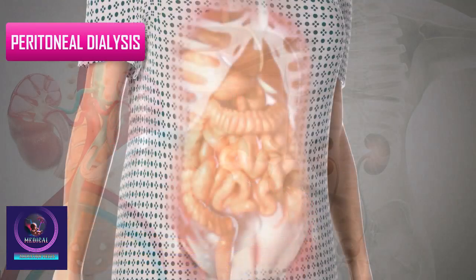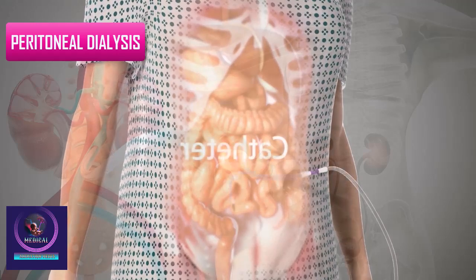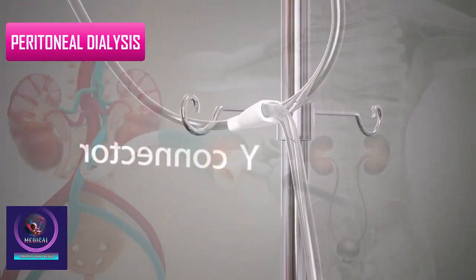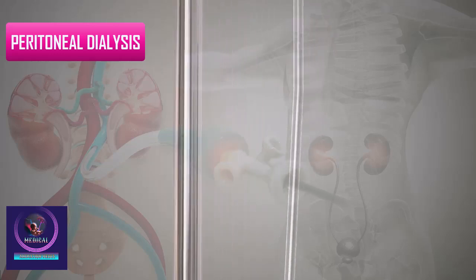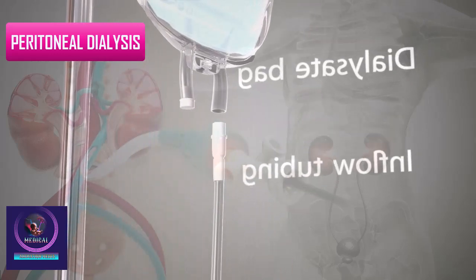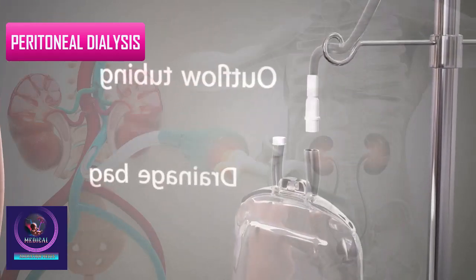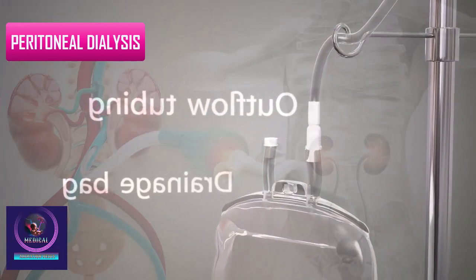Peritoneal dialysis requires surgical placement of a rubber catheter into the abdominal cavity. The catheter is connected to inflow and outflow tubing with a Y connector. The inflow tubing is connected to a dialysate bag and the outflow tube is connected to a drainage bag. Peritoneal dialysis occurs in exchange cycles.